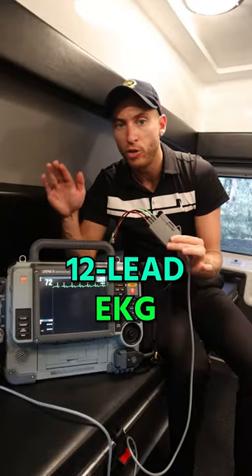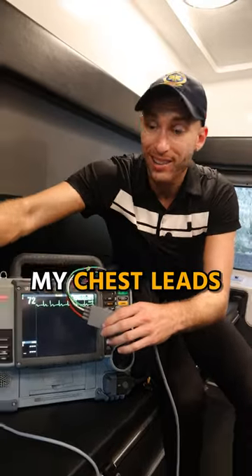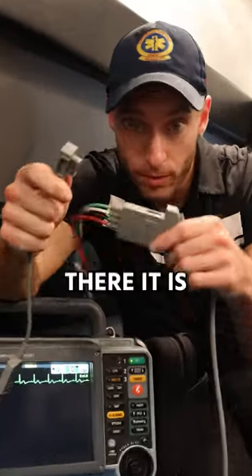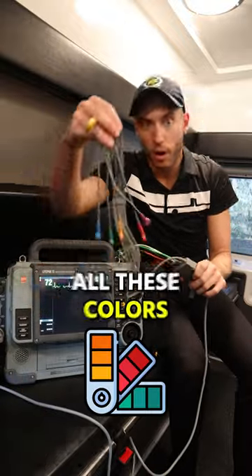What if I want to do a 12-lead EKG with the LifePak? I'm going to pop this off like this, and grab my chest leads. You're going to see a connection here — these connect. Now all these colors are your chest leads.